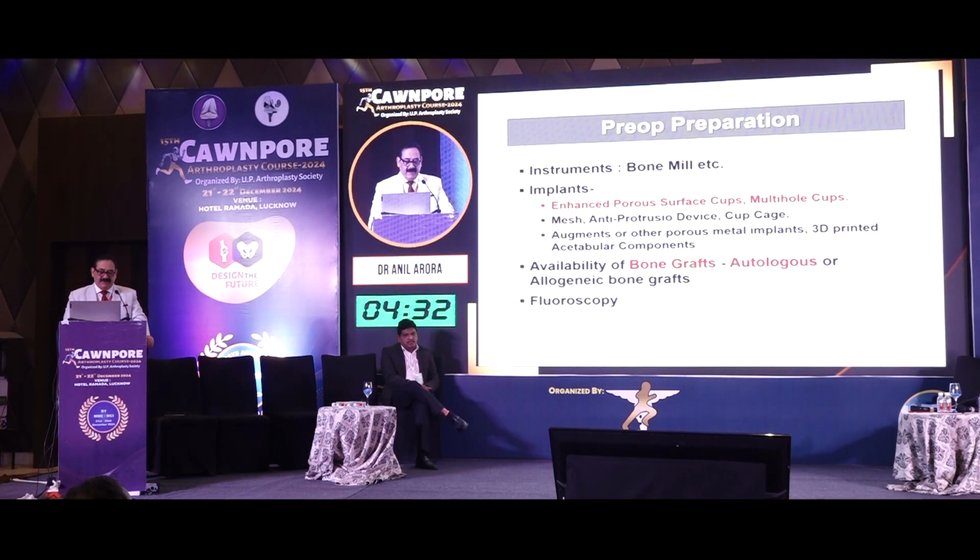Be prepared with the so-called enhanced porous surface cups, which have better osseointegration, multi-hole cups. If there is a medial wall defect, be prepared with anti-protrusio devices. Have bone grafts with you. Have an image intensifier also, if required.